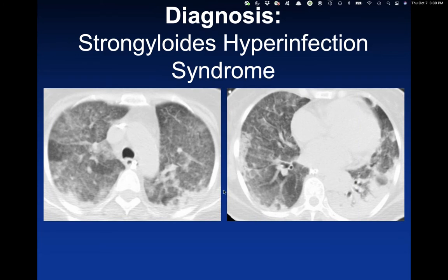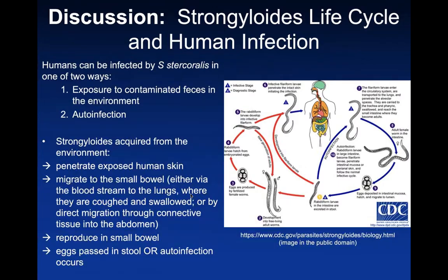Yeah, so this is one guy from Mexico who came to UCSF and got a renal transplant a couple months before this and presented with diarrhea and worsening sepsis. The diarrhea and abdominal purpura were the key. You can see it's very similar to yours, right? These are just tiny little, probably vascular nodules. He has more lung injury at this point.